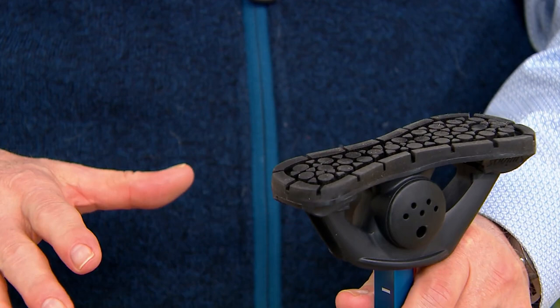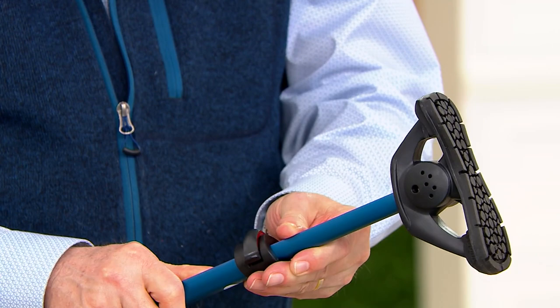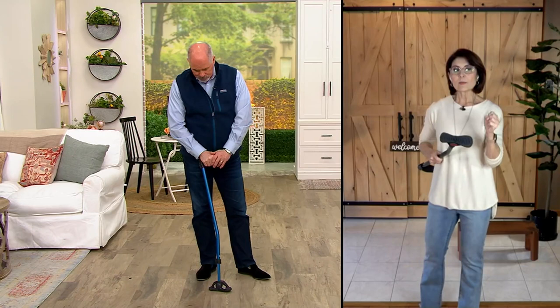It's fully adjustable. You pop these two levers and you can adjust it up or down to whatever you need. It's designed for anyone 4'6" up to 6'4", so it encompasses a whole range. Easy to adjust — you just pull, it's telescopic, then pop the pin back in. It's all about the utmost in support, balance, and traction, because you've got the biggest foot on any cane I've ever seen, covering more surface area and helping you to walk.